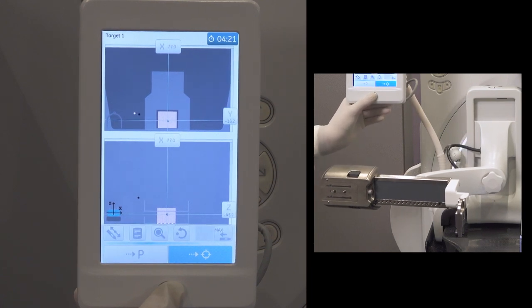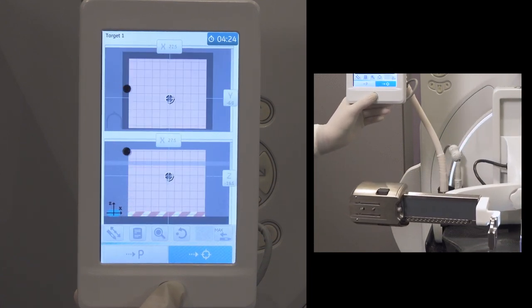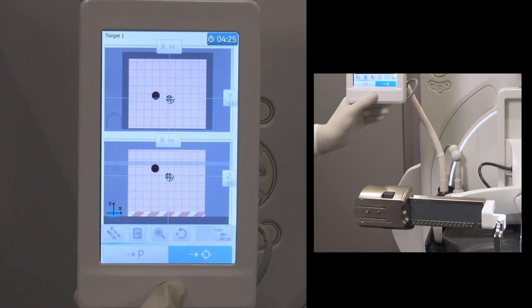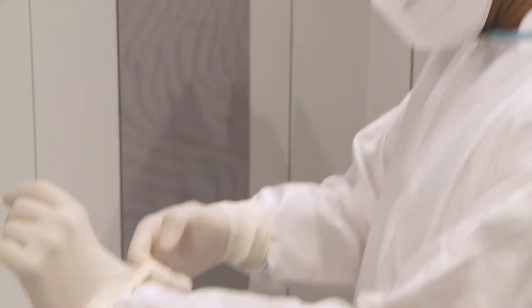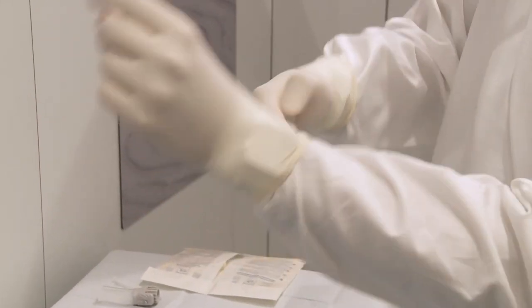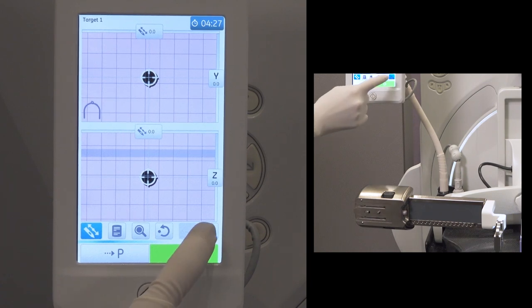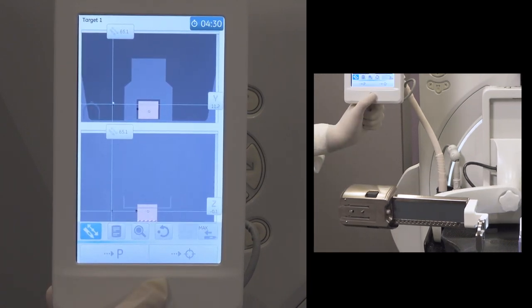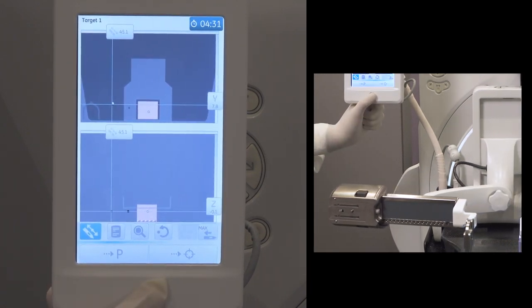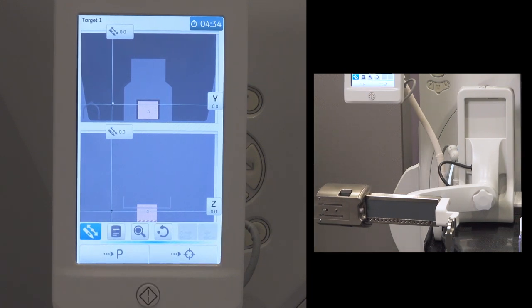On the biopsy display, touch the target button to drive the biopsy head to the target coordinates. Using the max needle preset button, drive the biopsy head backwards while maintaining the target coordinates to free space for anesthesia injection.